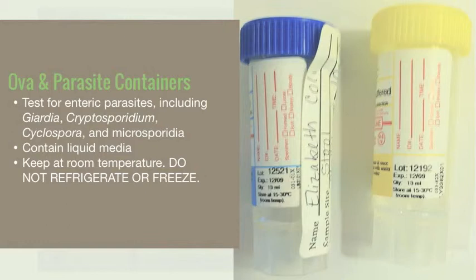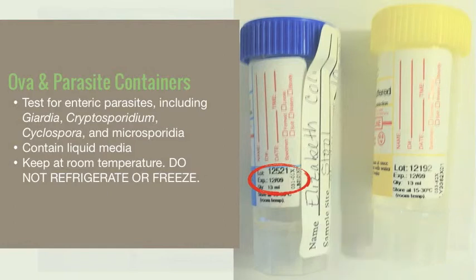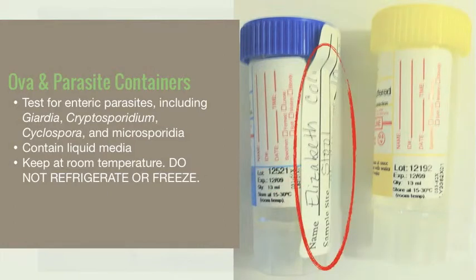Before using the tubes, make sure the tubes have not expired. Then label the tubes with the patient's name, specimen type, and collection date.